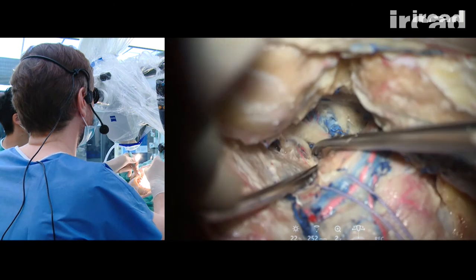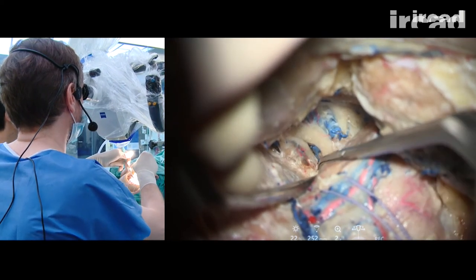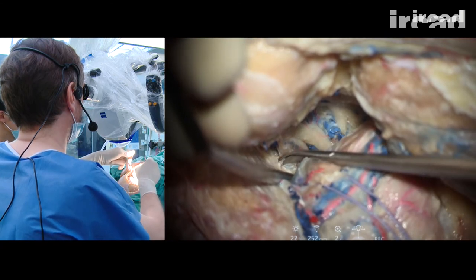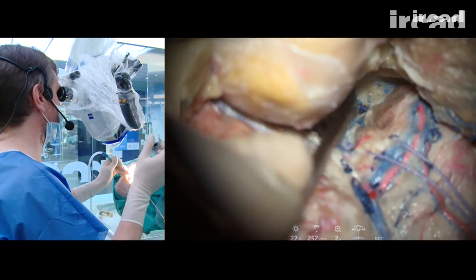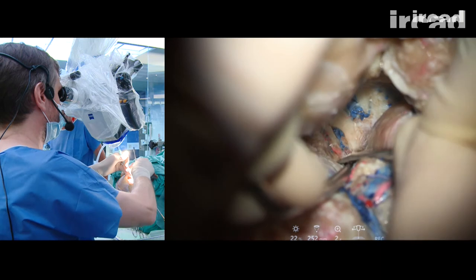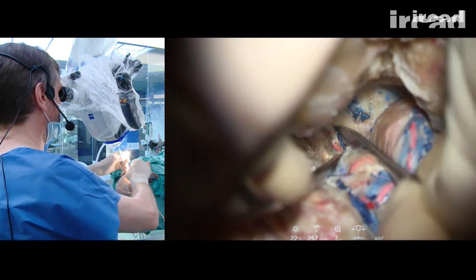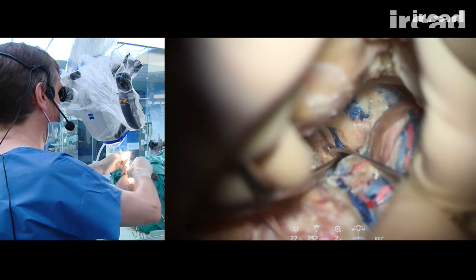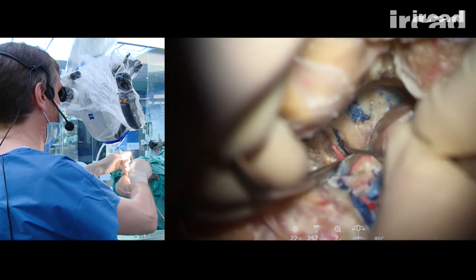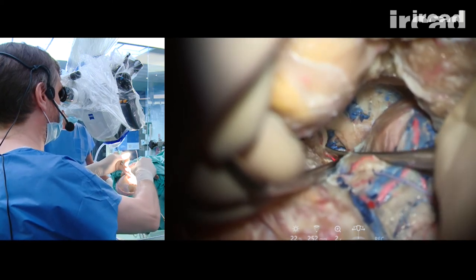Trigeminal ganglion. We can open a little bit more the cavernous sinus. And I can look for the sixth nerve, which is deeper into the cavernous sinus. This carotid artery here.